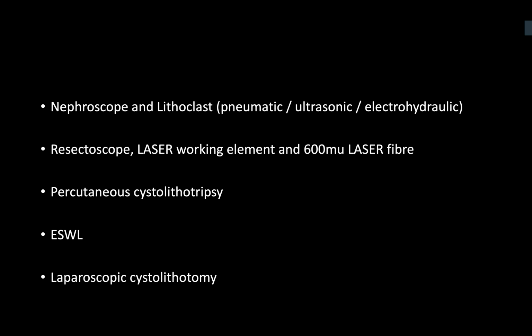Can we use shockwaves? They can. This could be considered as an option as well, but it's not very commonly used. Probably due to the bladder stone size often being larger, and therefore the chance of needing repeat sessions is far greater. And there may also be persistent stone fragments in the bladder, and therefore they may not pass out as easily.